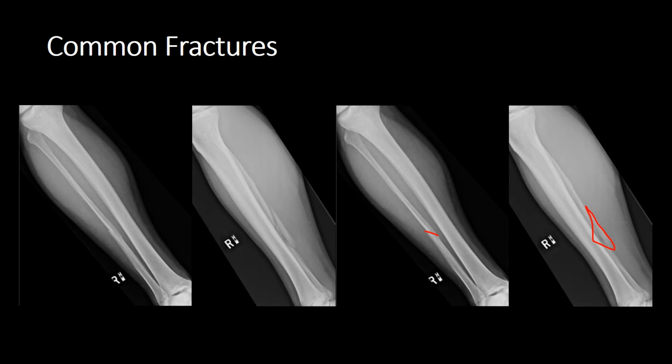So when you identify a butterfly fragment, it's really important to comment on it in your what, where, how.